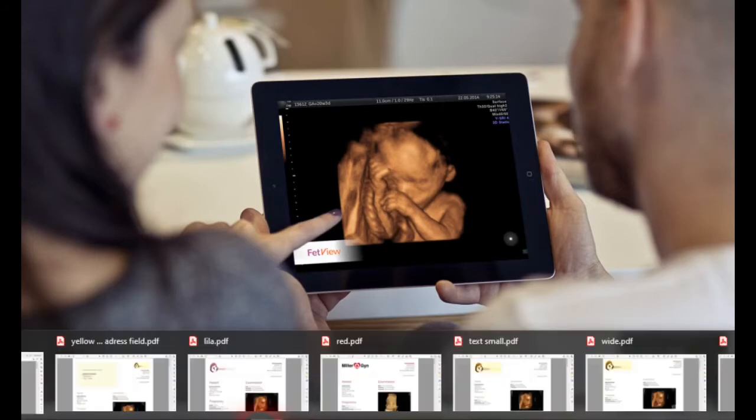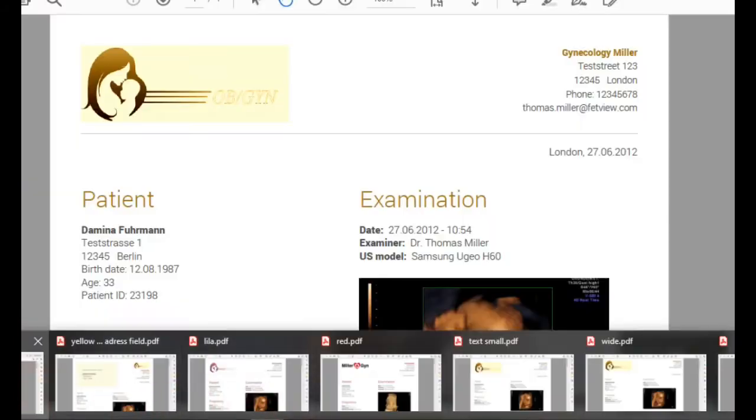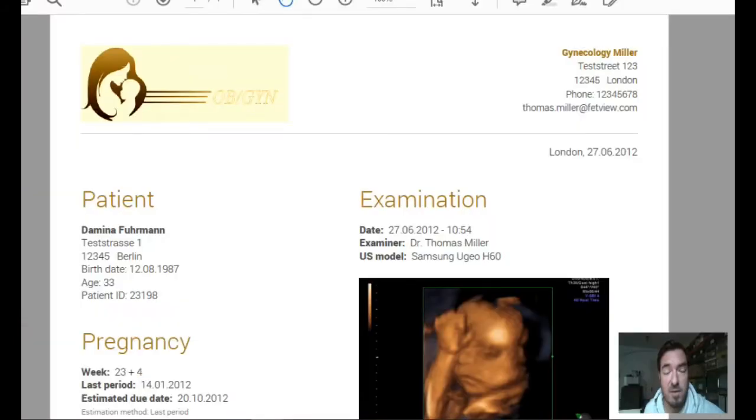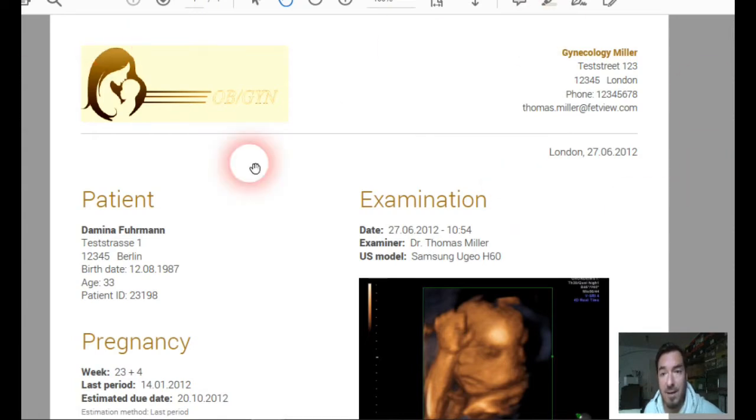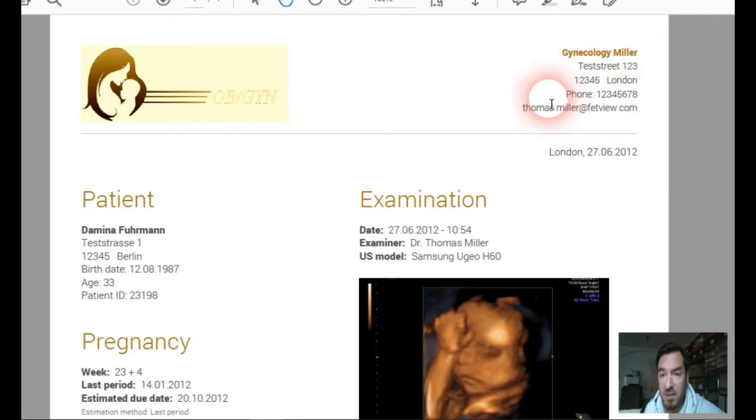In FetView there are various types of reports. The main two are the classical doctor report with your logo and the details of your practice.